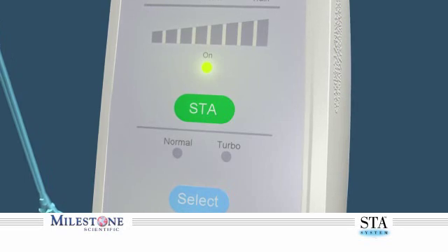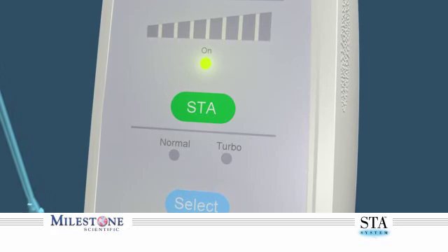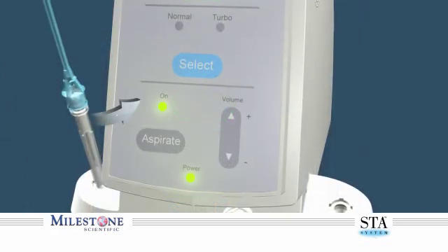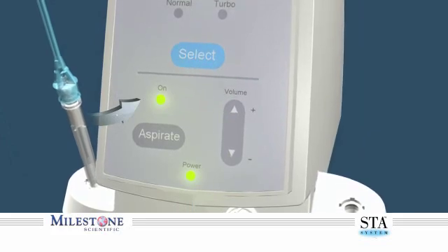Delivering the anesthetic at a faster rate than the controlled flow rate can result in adverse tissue reactions and/or tissue damage. Make certain the aspiration feature is on, as an aspiration test may be performed during anesthetic delivery.